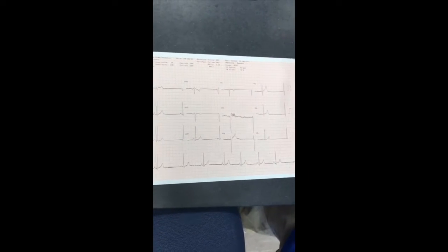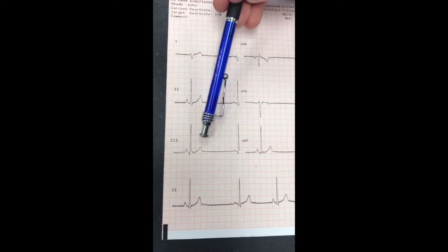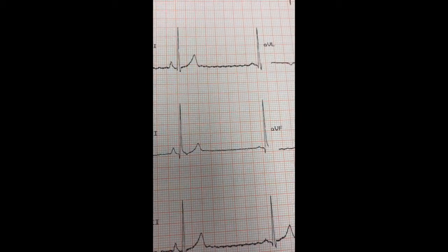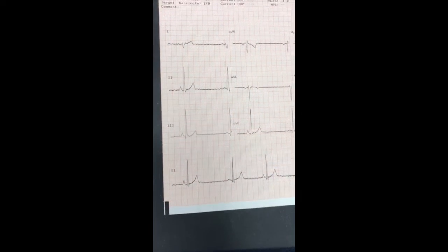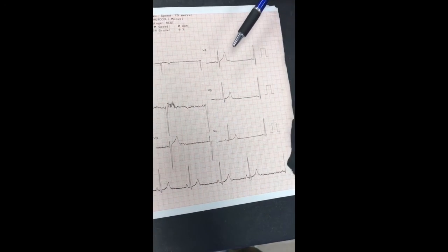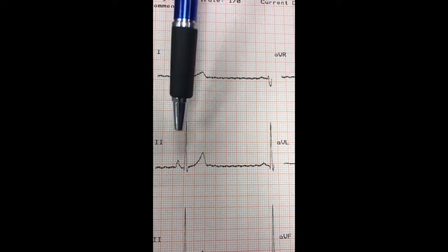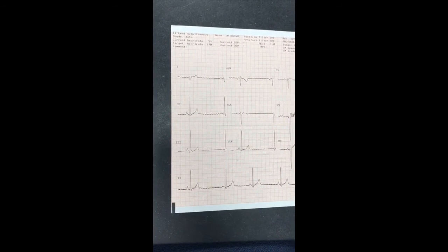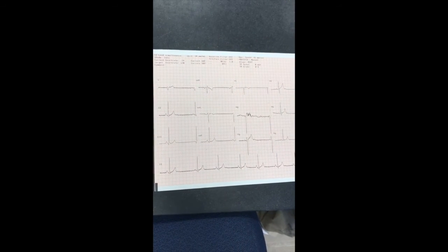Here we have our completed 12-lead EKG. Over on limb three, you can see we have a five large block tall positive QRS deflection, and that is the largest deflection out of any of the leads we have. Over on limb two, we have four blocks, so that is around the second largest we have. And this is our total completed 12-lead EKG.